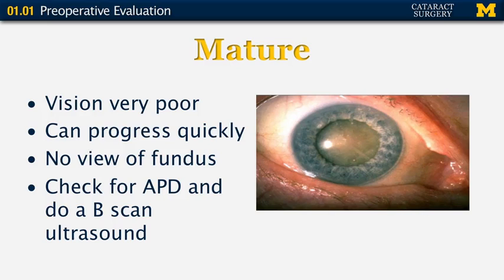As you can see in the photo, there's really no view of the fundus, and this eye has to be examined with some other modalities to determine that the back of the eye is okay. We'll be discussing those later in the talk.